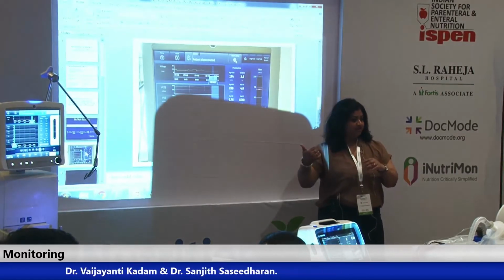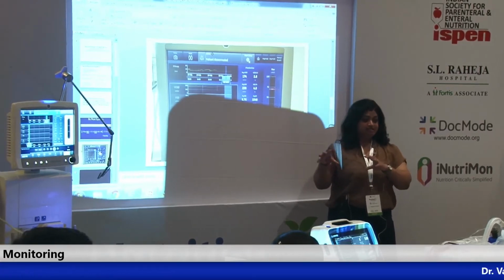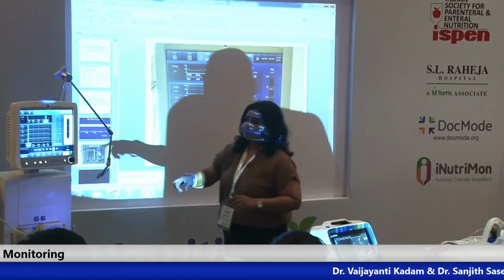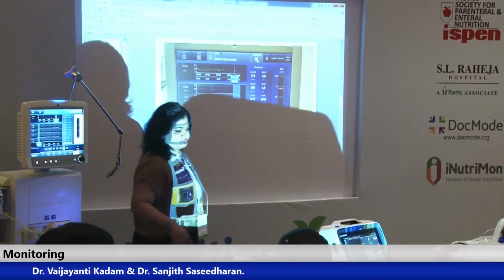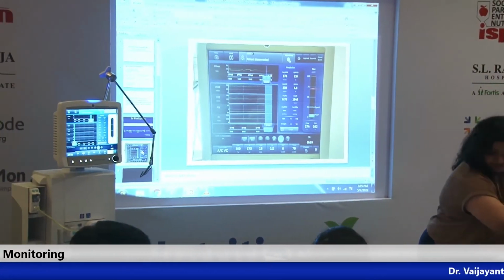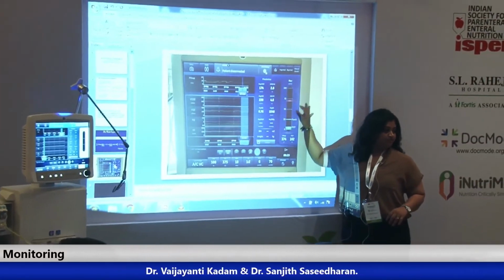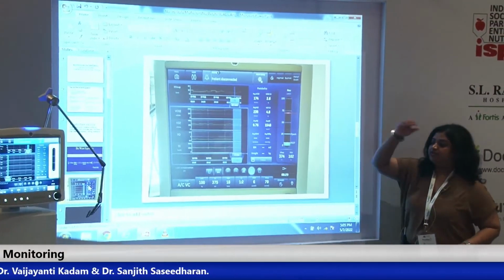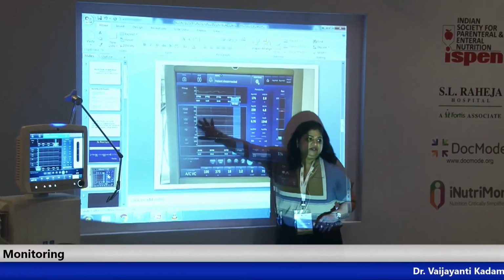On a ventilator, on this machine, how do we validate that it is in a steady state? There are two things we have to see. One is the variation. Okay, so this is our patient in the ICU. I've just clicked on this because we can't shoot on this. What it is showing on my patient is a time interval.